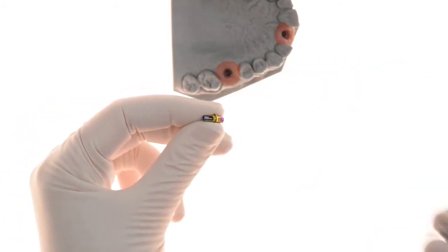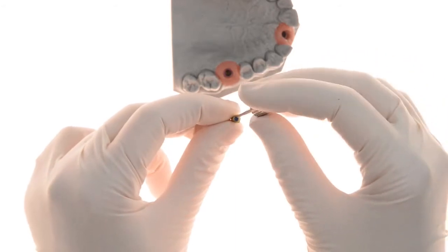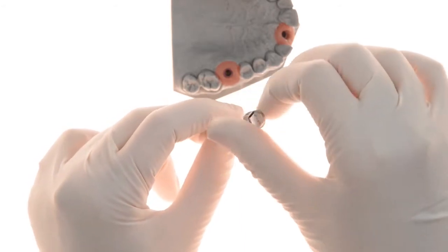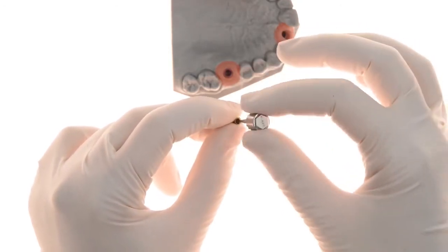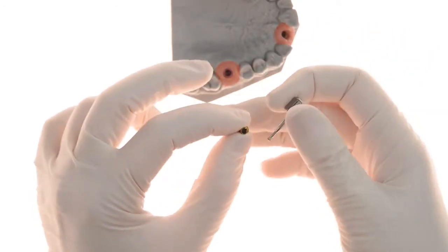The final restoration may be planned and milled where the screw is first positioned inside the abutment. Then the monoblock restoration is cemented to the abutment. Finally, the EasyBase restoration is screwed and tightened to the implant.